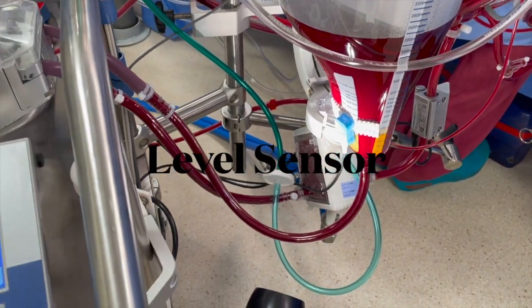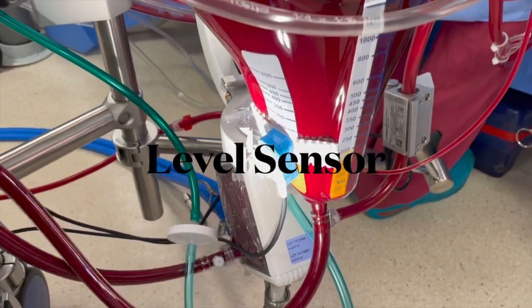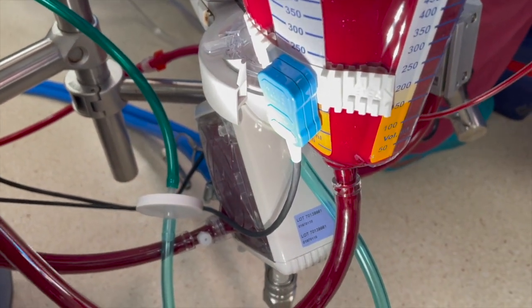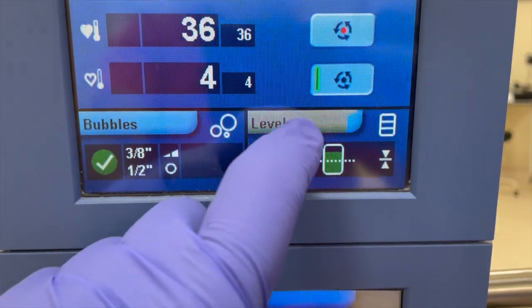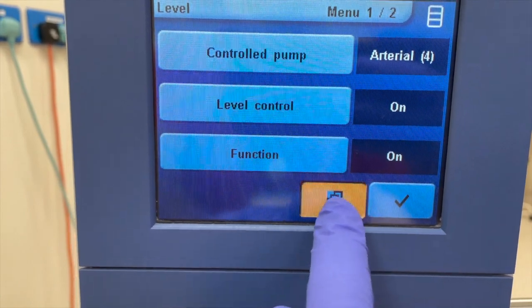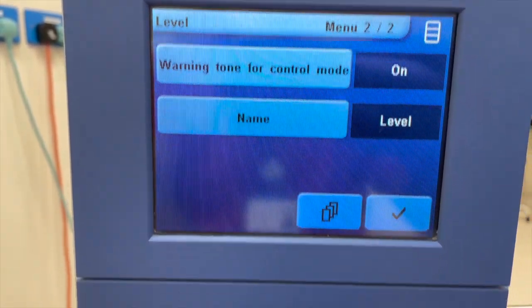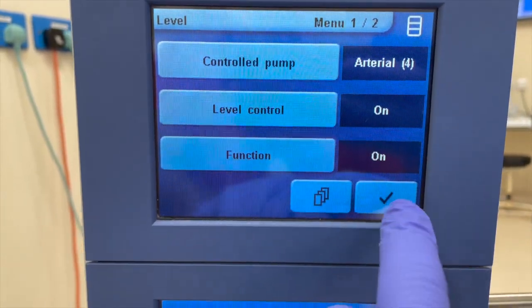This is a non-invasive level sensor system which is placed directly onto the hard shell reservoir at the blood level at which the perfusionist chose to be alerted. The level sensor is capable of audible and visual warning of low blood level, simultaneously stopping the arterial pump to avoid emptying the reservoir and stop air entering into the cardiopulmonary bypass circuit.